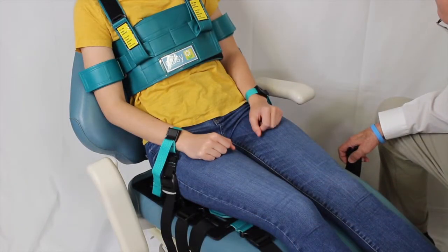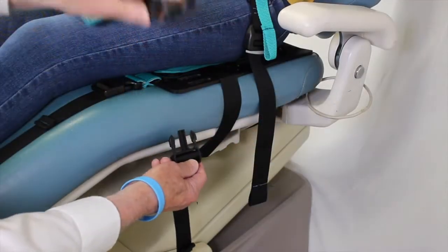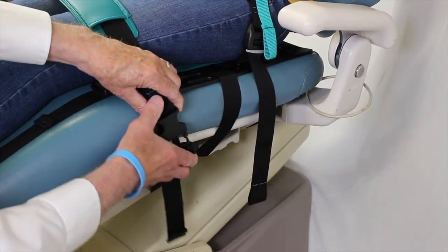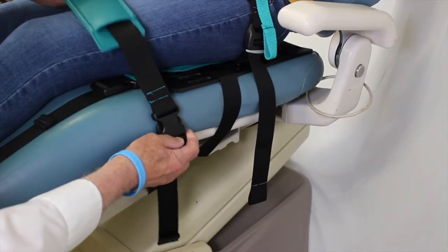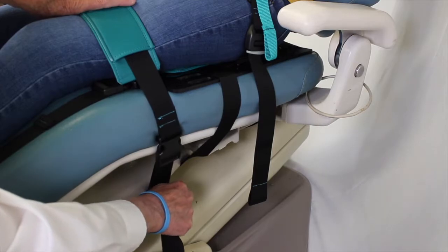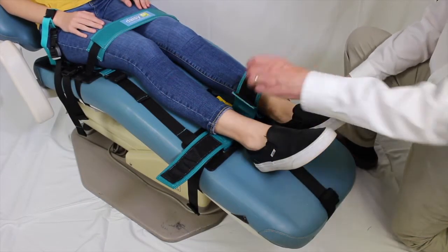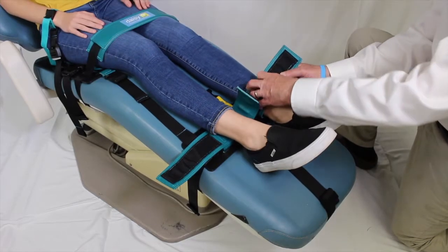Thigh strap. Position and adjust the thigh strap over the patient's thighs. Position the buckle before you tighten the strap. Attach the buckle and tighten the strap. Adjust the thigh strap tight enough so that the upper legs and hips of the patient can be held in place. Leg straps. Position the patient's leg and apply the wrap around each leg.